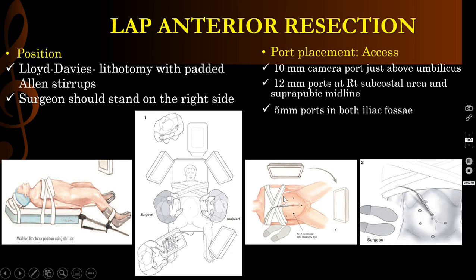Here you have to fasten the patient to the table properly, because you will be putting the patient in steep Trendelenburg position, and you will also put the right lateral position. For that, you have to fix the patient's chest to the table adequately.